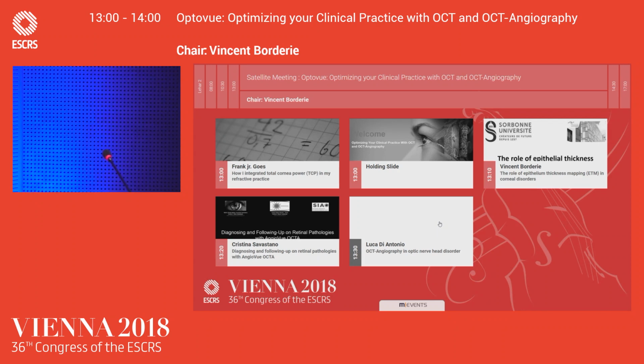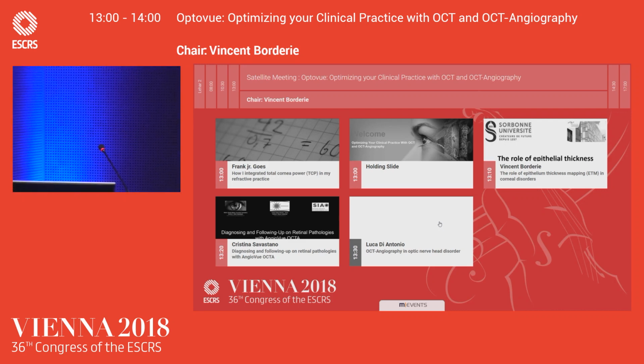Okay, thank you. In Alzheimer's disease, there is a recent publication in JAMA Ophthalmology that said that the better tool for monitoring the disease is the RNFL thickness. But now it's possible to extend this tool to OCT angiography applied on the macular area, because the vessel density impairment of the superficial capillary plexus is an early sign of Alzheimer's disease.